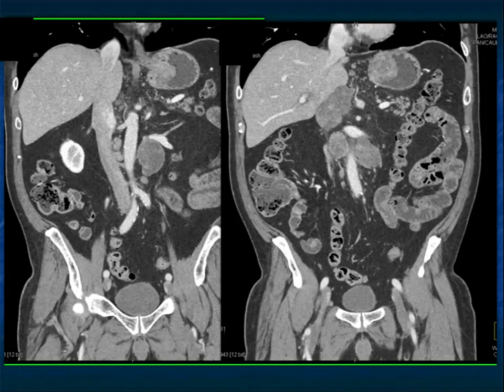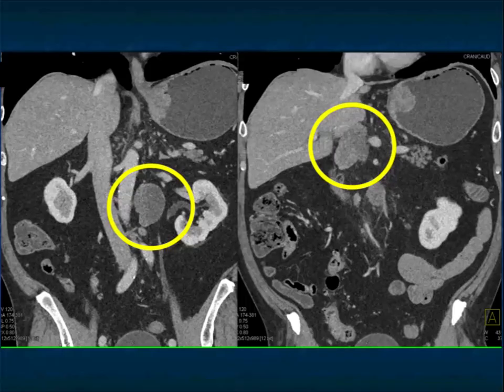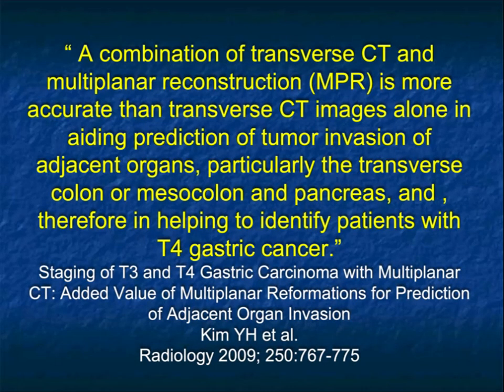And you can see in that same patient, besides the portal caval nodes, the large aortocaval nodes, and the large left paraaortic nodes. One thing to comment on, we typically would say when there's bulky adenopathy, you think about lymphoma. Also, when nodes extend beneath the renal hilum, you think more about lymphoma than you think about adenocarcinoma. But this is a great example showing you how large and bulky gastric adenocarcinoma can be, and it does make the point that you don't need to see small nodes.